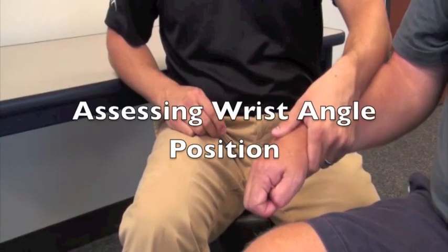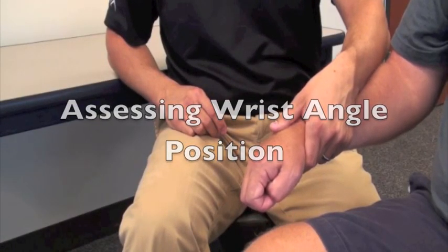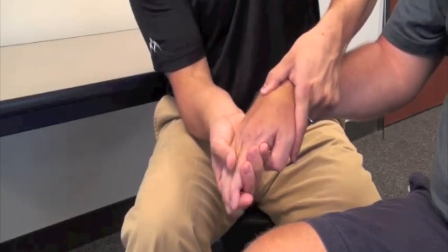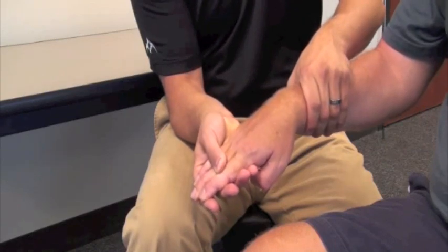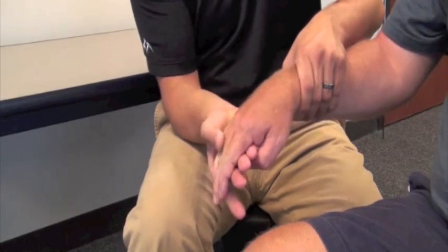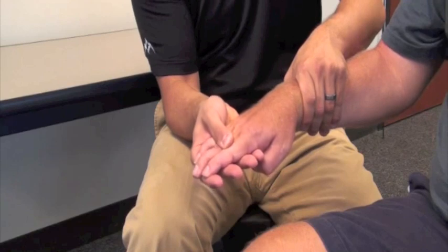Before we fit Tony with the Sabo Stretch, we first must determine where we want to set the wrist angle to maximize the stretch on the finger flexors. To determine the appropriate wrist position, let's drop the wrist into flexion and straighten out the fingers. We're going to slowly bring Tony up towards neutral until we feel that first resistance — the index finger and the middle finger will start to resist.